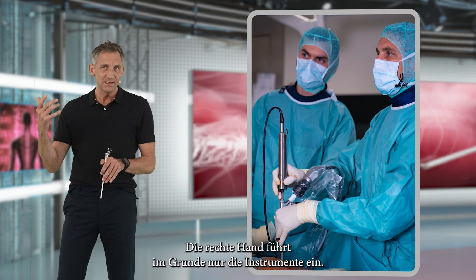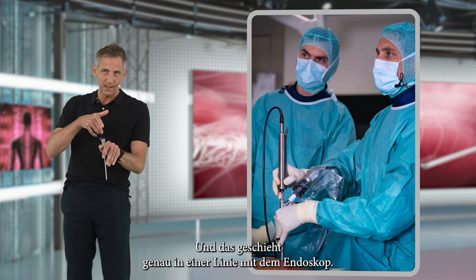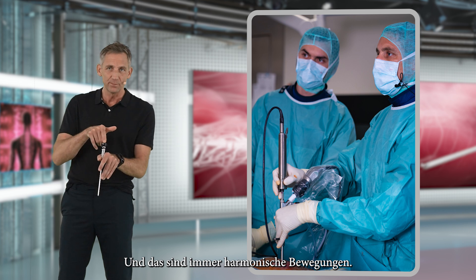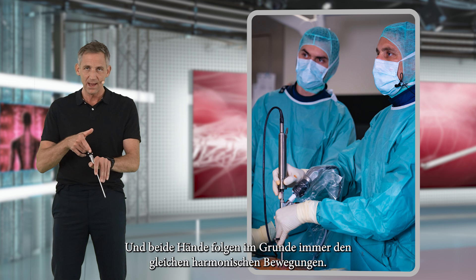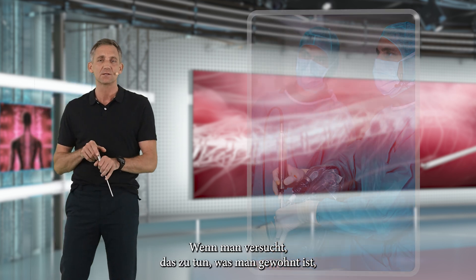The right hand basically only inserts the instruments, and you do that exactly in line with the endoscope. These are always harmonious movements. So you turn left and you turn right, and both hands basically always follow the same harmonious movements.